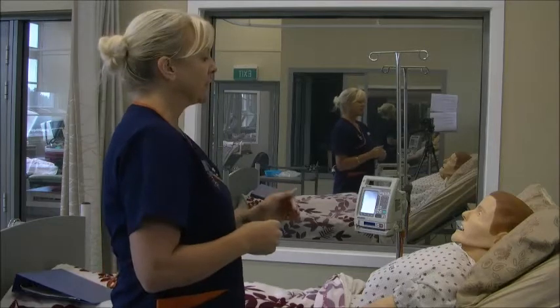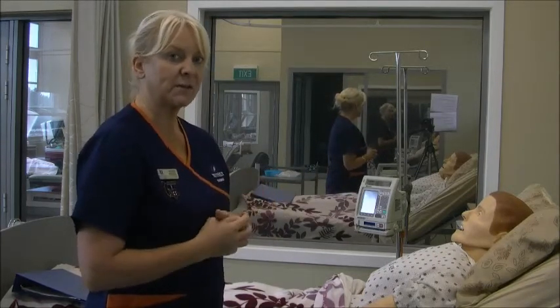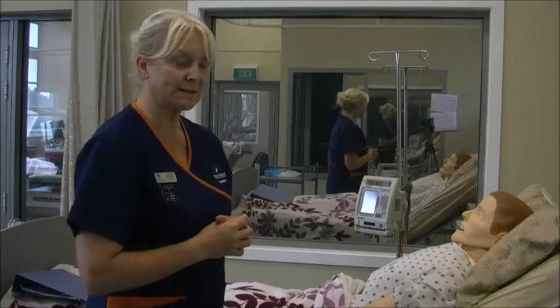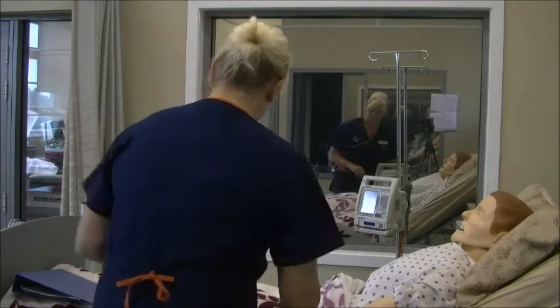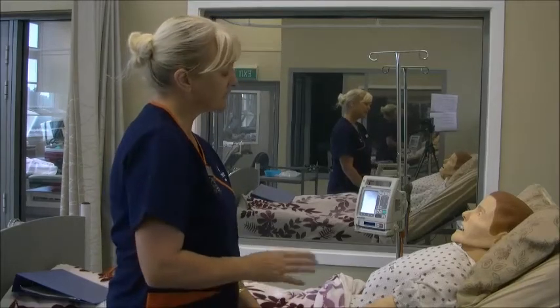The next thing I want to do is, once those two things are established and I have no concerns with his airway, is do a set of vital signs. So that's what I'm going to do next. So, George, if it's okay with you, I'm just going to check your blood pressure.